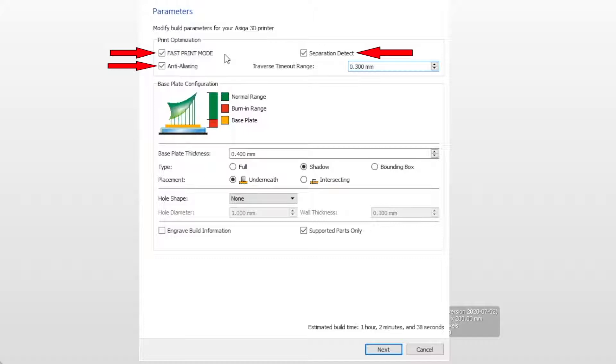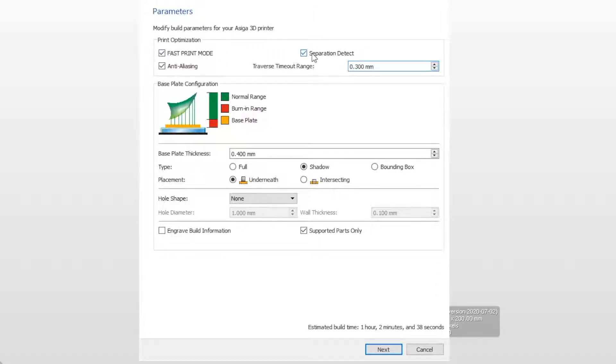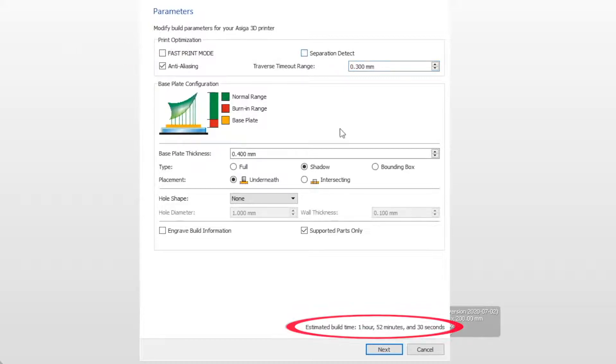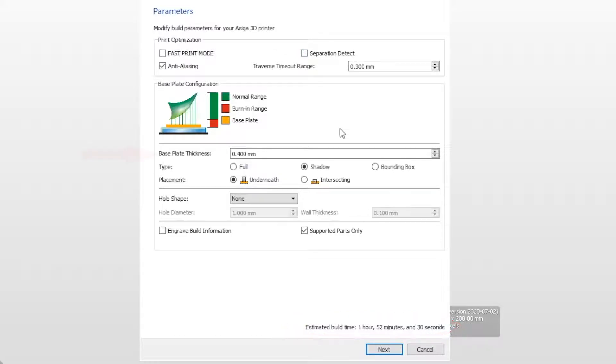If this build is using the same information as a previous build, the print optimization buttons may already be selected. If not, make sure the fast print mode is checked on. The build time for this print is estimated to be one hour, two minutes, and 30 seconds. If the fast time mode is disabled, the build time becomes one hour, 52 minutes, and 30 seconds. Next, make sure the base plate thickness is at least 0.4 millimeters thick. Then select next.